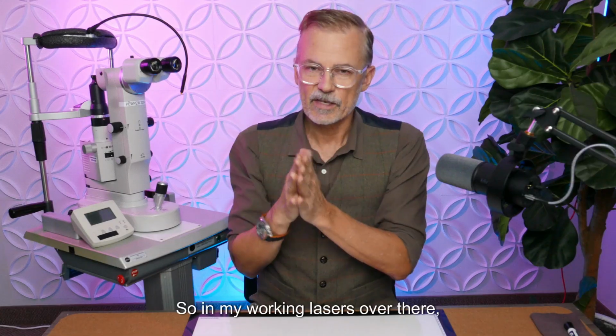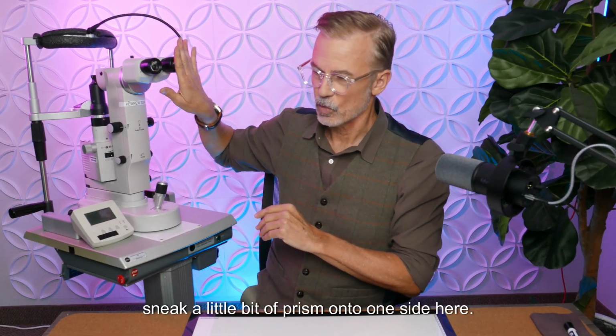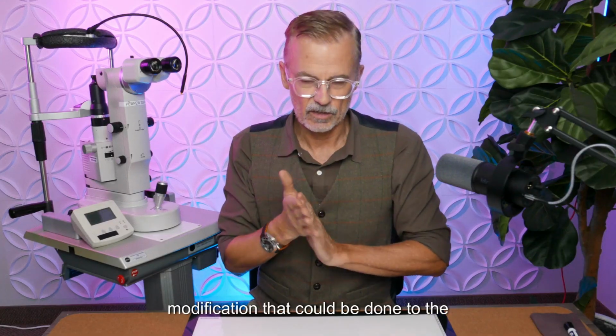So in my working lasers over there, I've got a way to sneak a little bit of prism onto one side here. It's about 3 diopters. It isn't much. Base in prism there, and that's a modification that could be done to the optics there.